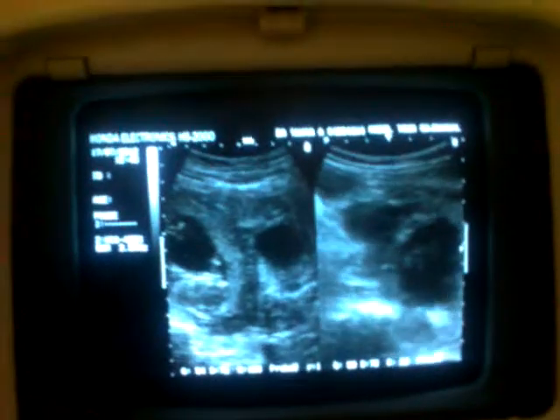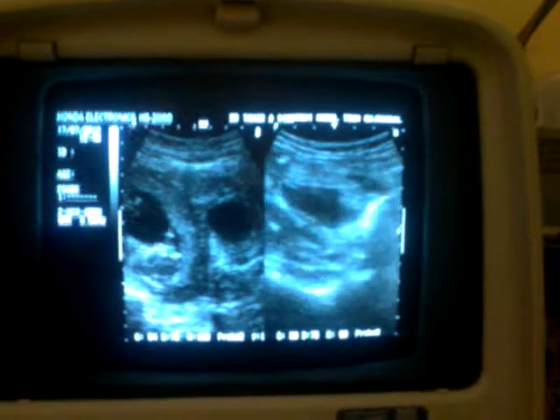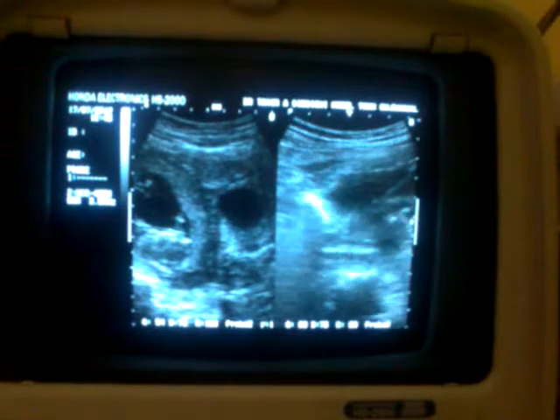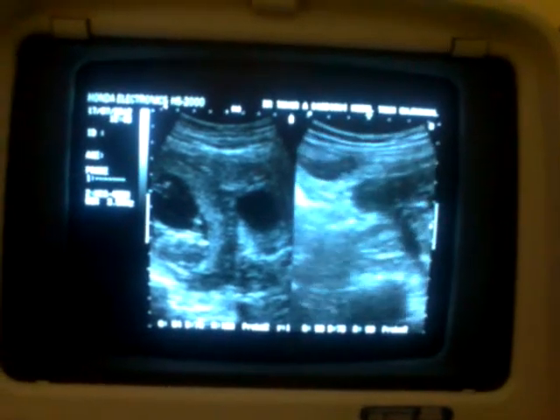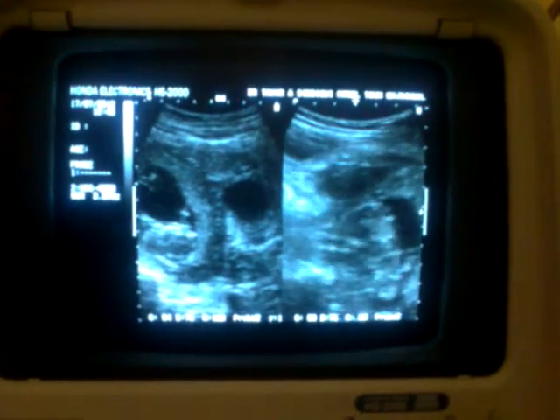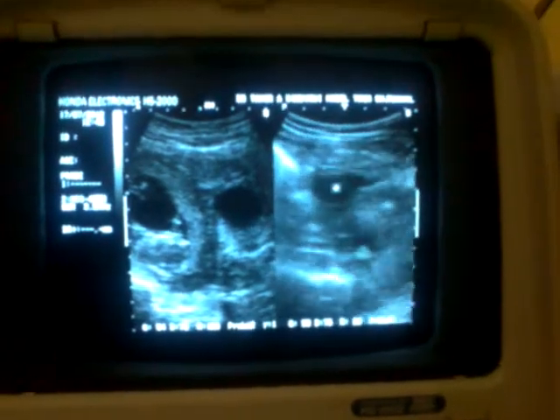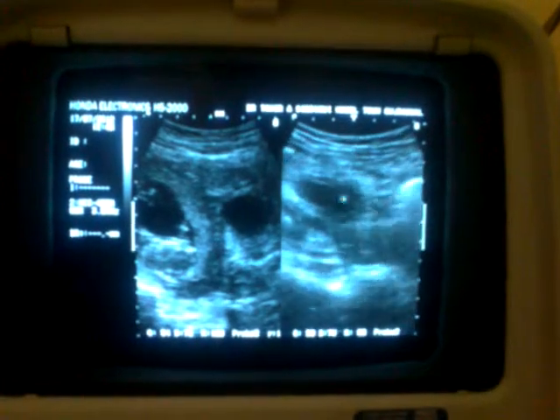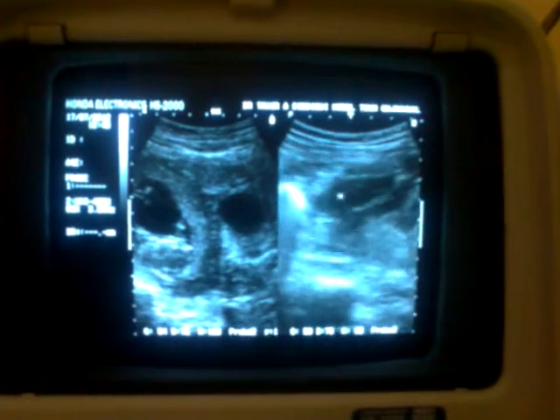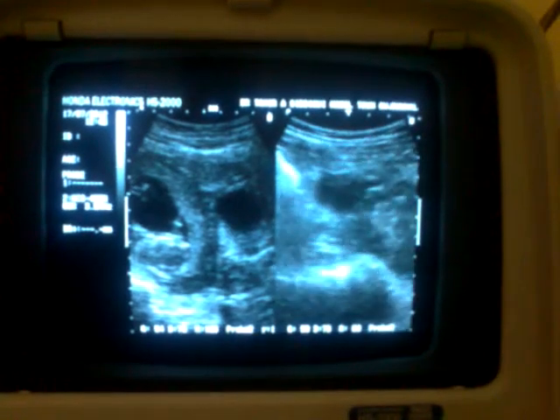Now this is the third sac. Now this is an ectopic pregnancy in the right tube. This is the third one. So these are triplets in fact. Concentrate again on this sac. I am going to give a 90 degrees sweep to this area to see if it changes its shape or not. It does not. It maintains its shape. And it is empty.